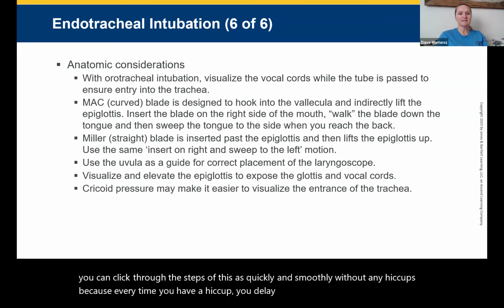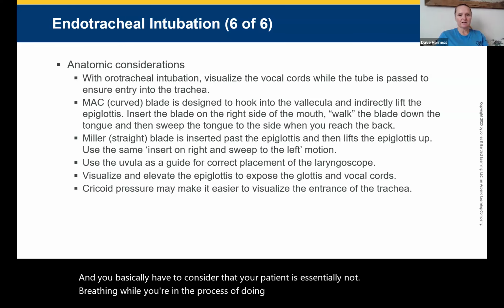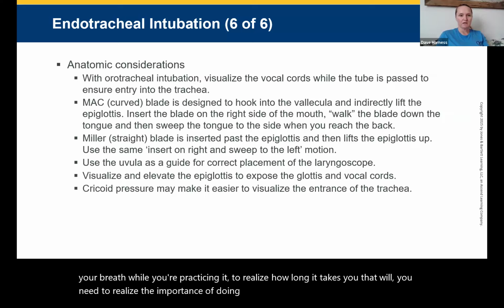And you basically have to consider that your patient is essentially not breathing while you're in the process of doing this. So, if it helps you to hold your breath while you're practicing it, to realize how long it takes you, you need to realize the importance of doing this quickly and smoothly.